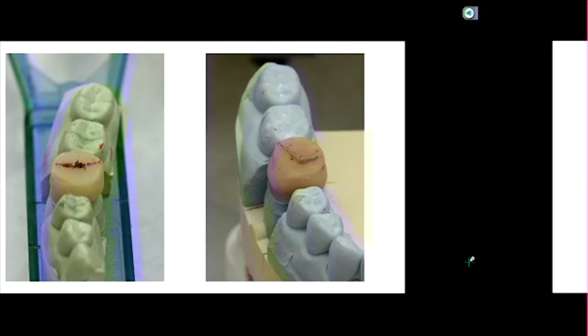So you may have a situation where you've designed a crown on a triple tray, and on the triple tray you test it, you go in all the movements, and you think, oh, great, everything looks good, I have no interferences. And then you go put it in the patient's mouth, and then you'll find, oh, it's hitting somewhere I don't want it to hit, because now that upper tooth actually follows the path on the right. Are we good with that?